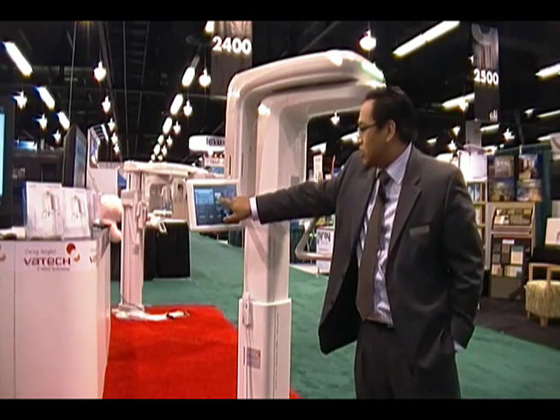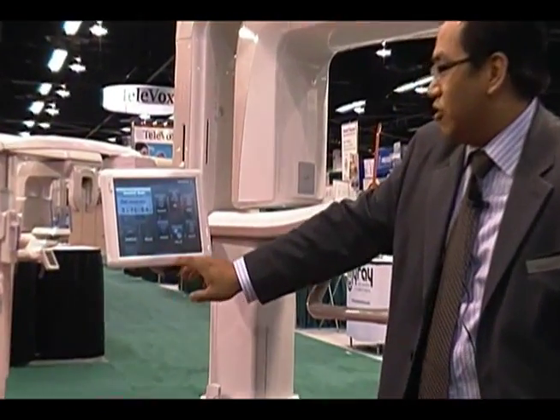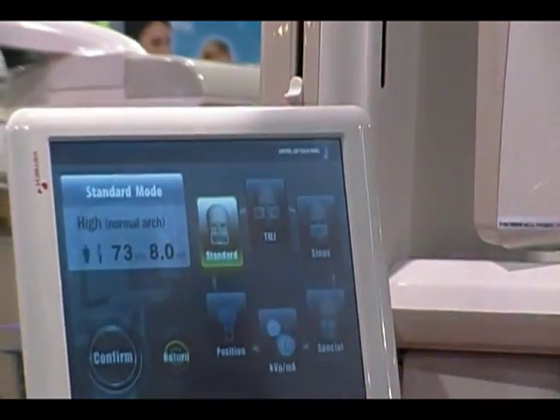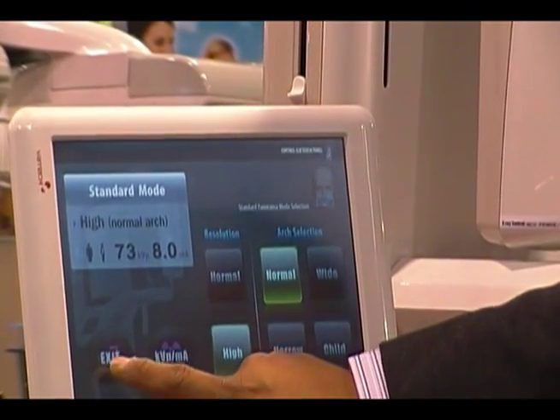All the staff member has to do is touch the different modes. We have different panoramic modes and a couple of different preset settings. What's nice about this is that the KVP is automatically set, adjusting to the patient. So depending on the patient's age and size, all the KVP and MA settings are set automatically.